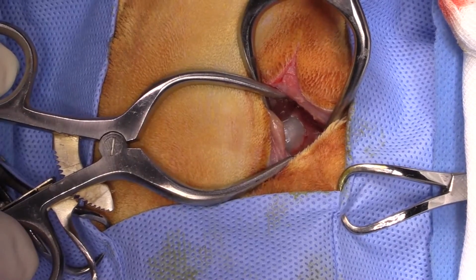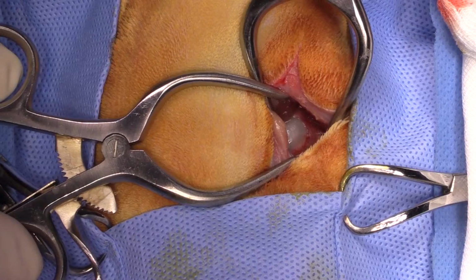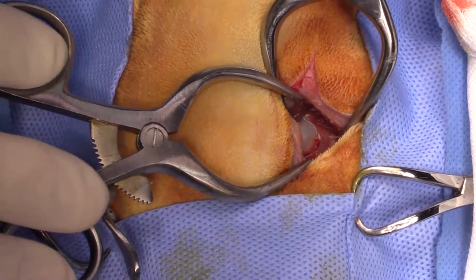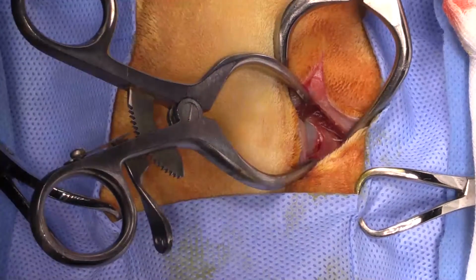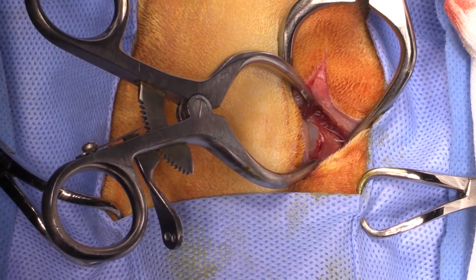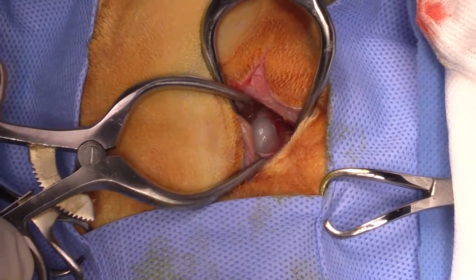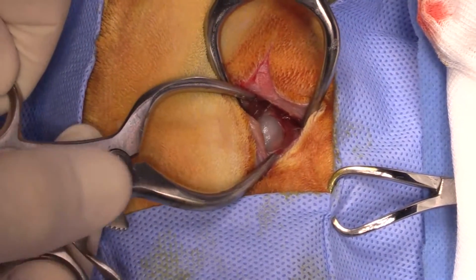And did we get our pins? Yeah, that's fine, thanks. Just lift it up a little bit so when you pull it, yeah.